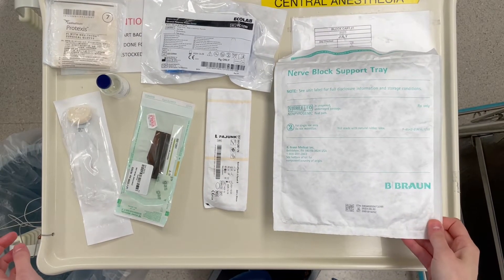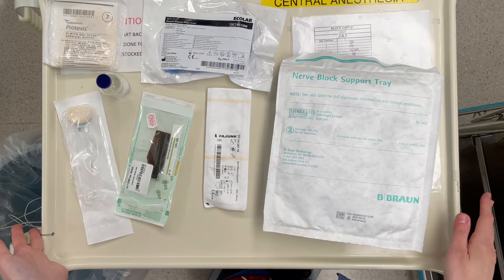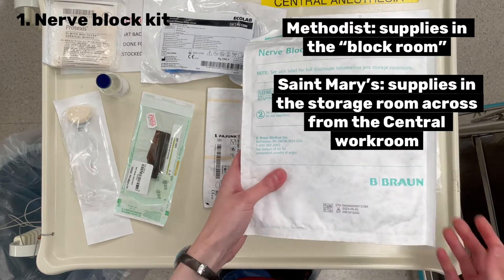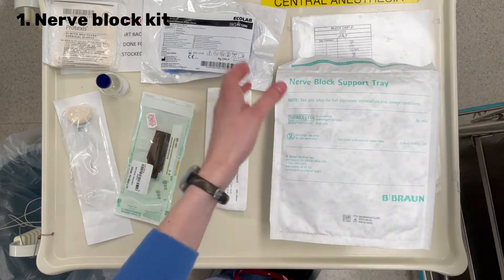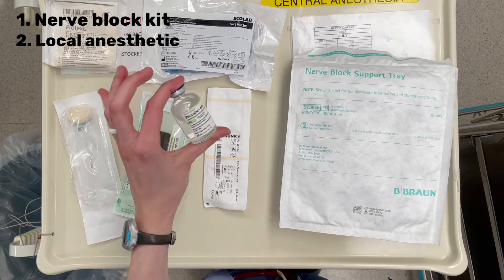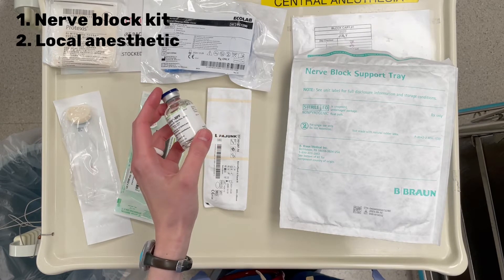I'm going to show you how to set up a nerve block kit for a single-shot ultrasound-guided nerve block. So what you'll need: a support tray — I've seen this one the most, so we'll go with this one. You'll need your local anesthetic, which will be a discussion with your consultant and possibly the surgeon. Usually we do bupivacaine or mepivacaine.